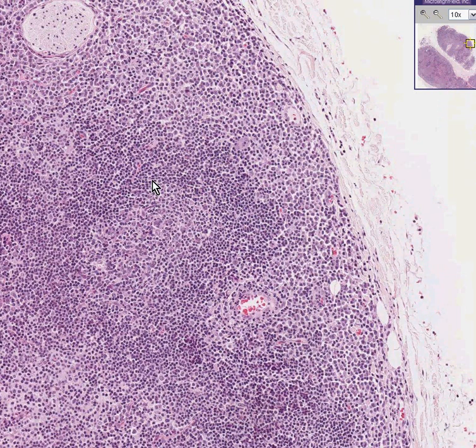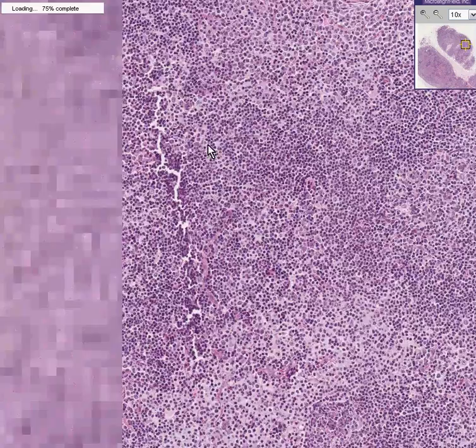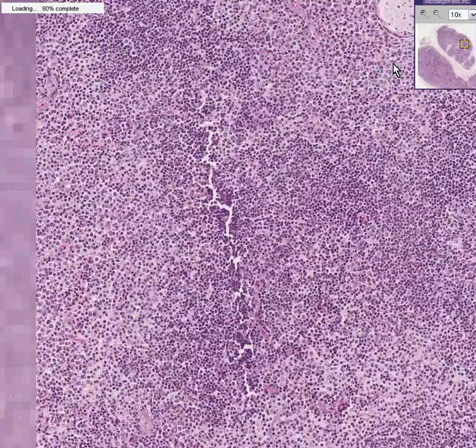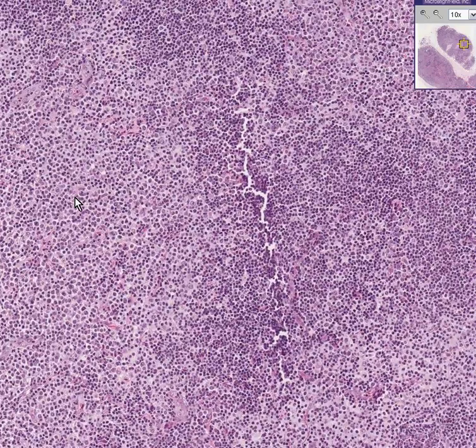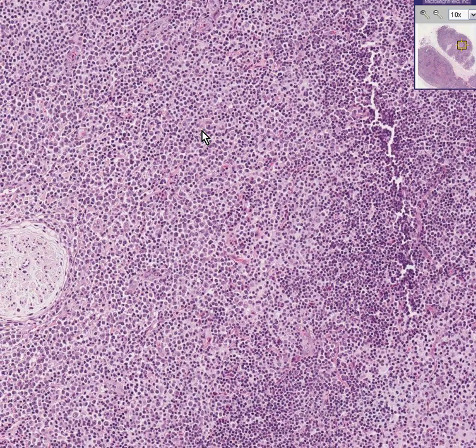As compared to our mantle zone lymphoma, which was a proliferation of lymphocytes right at the edge of the germinal center, the marginal zone is that next general layer of cells past the mantle zone, and that's basically the main cell of proliferation here. So if you would stain most of these cells in the lymphoma, perhaps even in areas where there's no follicles, you would see there were B cells, and their origin would be from the marginal zones.